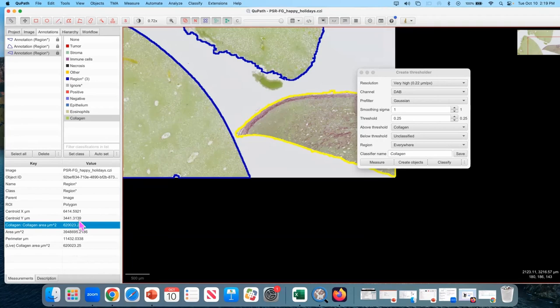I've done it on trichrome. You have to set your vectors such that you see the blue, and then the blue pops up. Our core has found that the difference between the red and the fast green is so distinct that this works really well, and you just set a threshold and you're done. The trichrome, the blue of the collagen tends to bleed into the purple of the muscle layers. So it's just a little harder. It's just a little more vague. I've done it. There's, I think, in the folder.